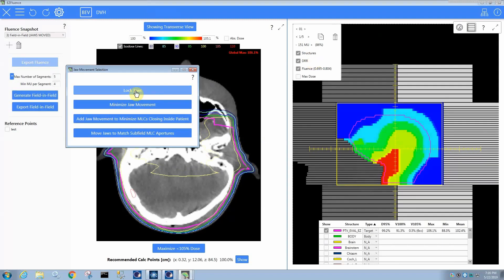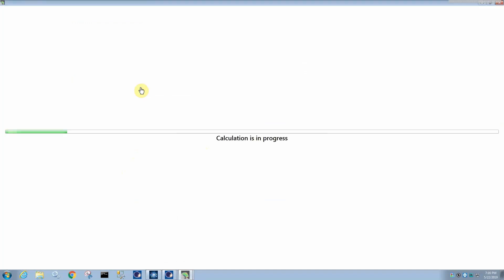If we decide to lock the jaws, so you can see in the video on the administration application, you can actually set a default where it always allows jaw movement. But if you select a prompt in the administration application, this window appears. So say you want to lock the jaws, such that you can merge all your subfields. Now EasyFluence is going to run that field-in-field optimization in a way that it will not allow the jaws to move, and it will not allow carriage shifts.